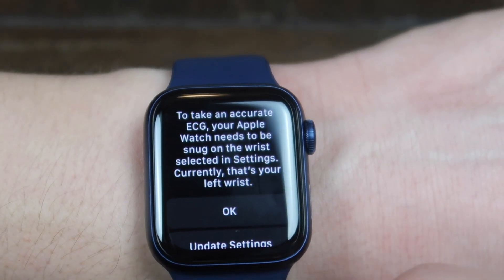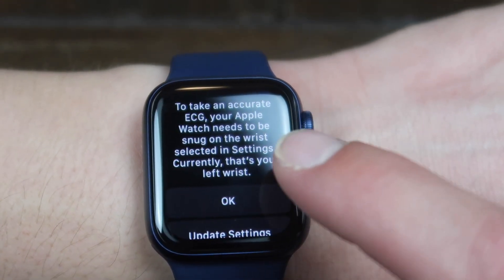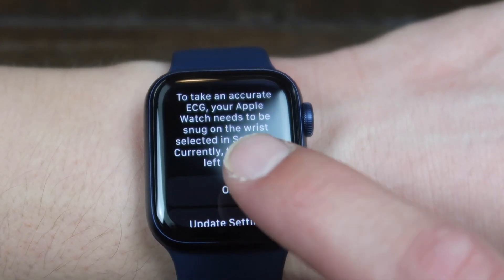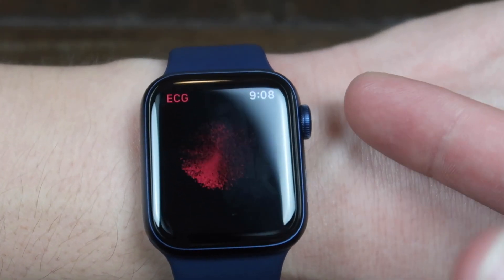It says to take an accurate reading, your watch needs to be snug on the wrist. Select it in the settings. Currently, that's your left wrist. Make sure that's up to date. If not, you want to update your settings.